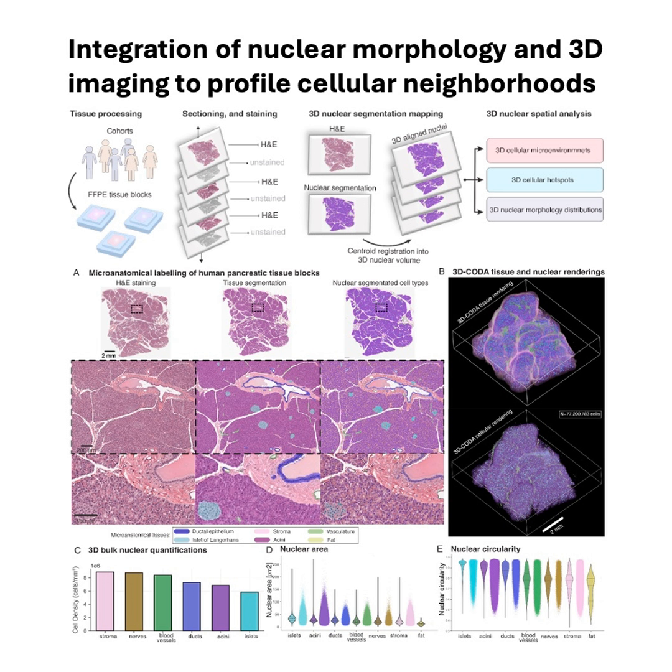Once each nucleus was segmented, they automatically extracted a whole suite of features, over 20 different measurements for each nucleus. Like what? Things describing its shape: area, circularity, aspect ratio, mean radius, but also its size, and even its stain intensity. They looked at the mean and standard deviation of the red, green, and blue color intensities from the H&E stain. Wow, like a detailed biometric profile for every single cell's nucleus. That's a good way to think about it, yeah.